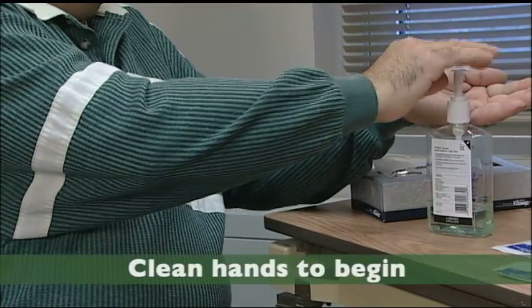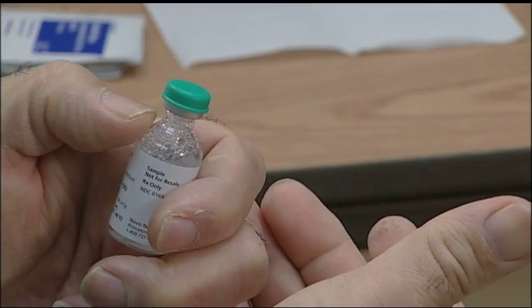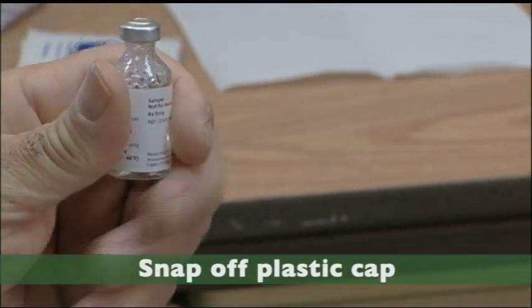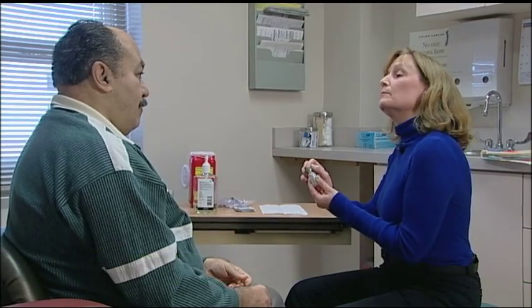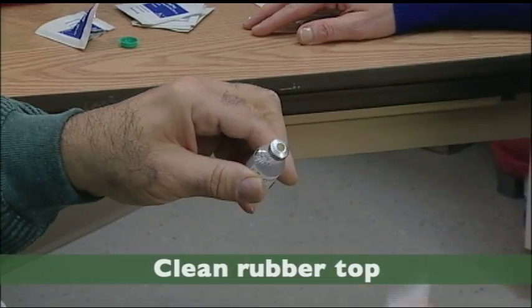The first step is to make sure your hands are nice and clean. Since we're not using soap and water here, we're going to use a hand sanitizer, but at home you could use soap and water. New insulin bottles often have a hard plastic cap on top — you need to snap that off to reveal the rubber top before you start the injection process. Go ahead and take an alcohol swab and clean the rubber top.